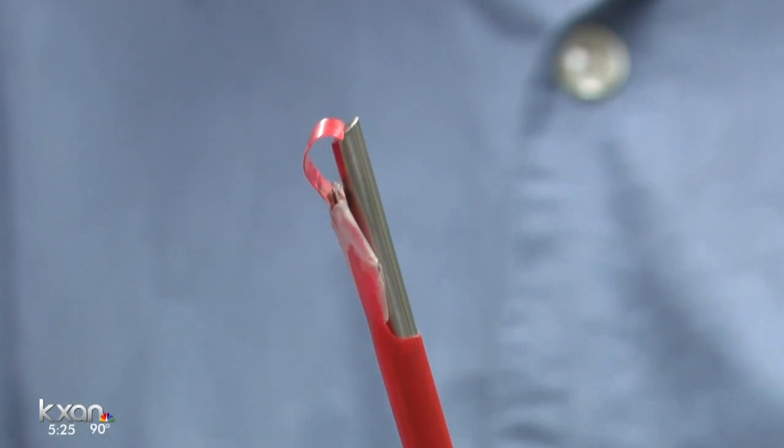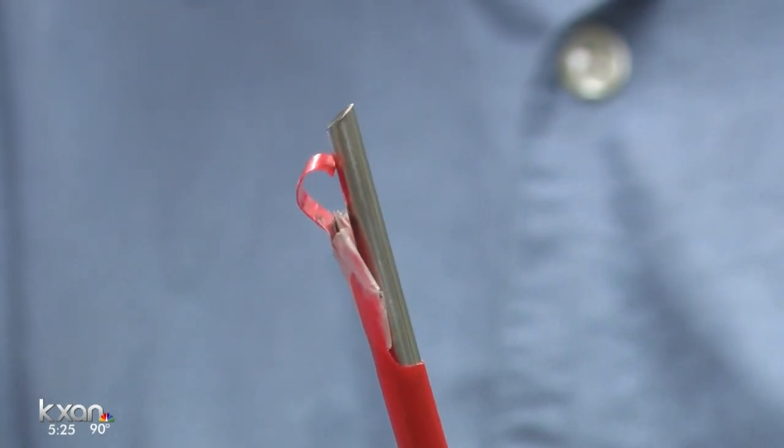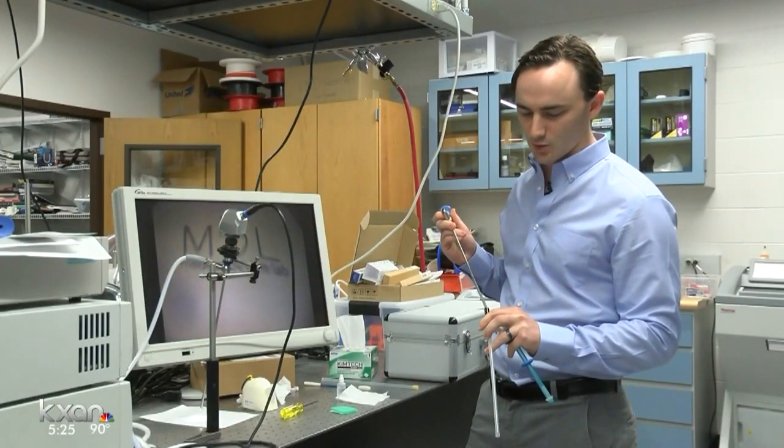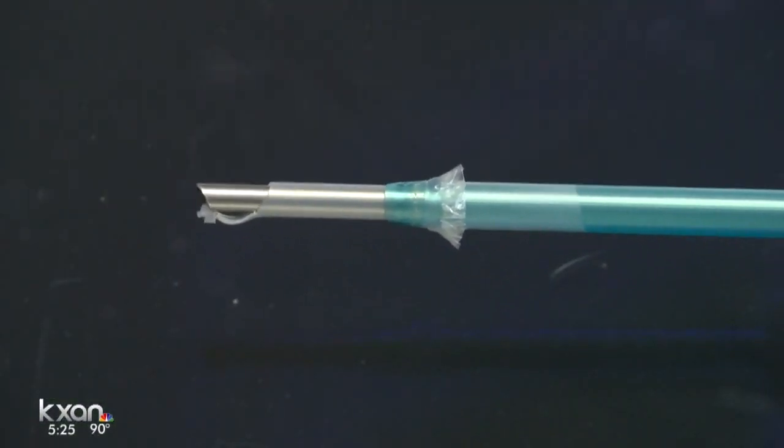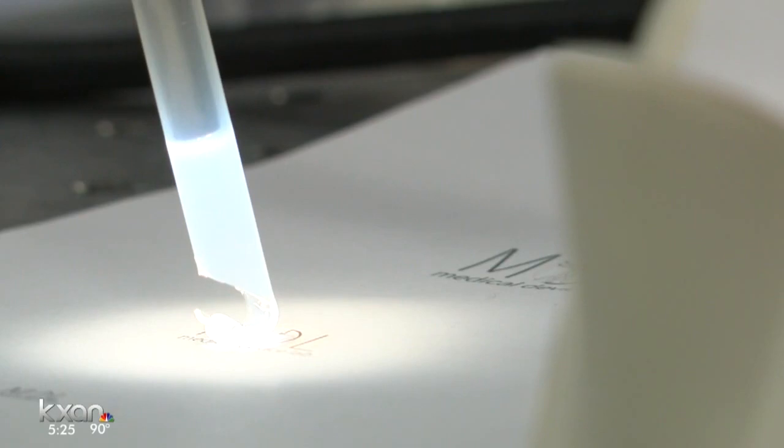Researchers realized a drinking straw with a scoop at the end might hold the answer. I would describe it as an equivalent to the squeegee for the laparoscope. This model is now part of the medical device startup ClearCam.